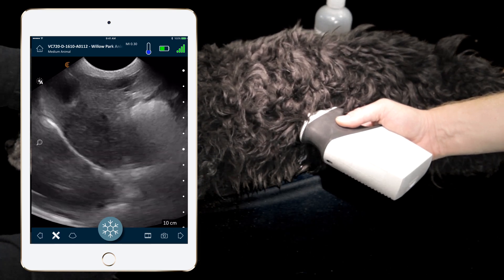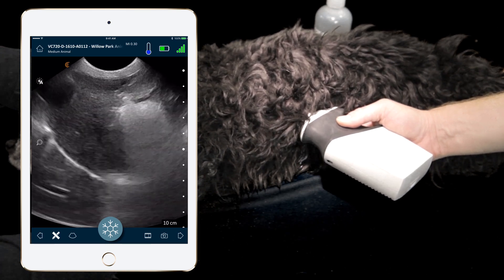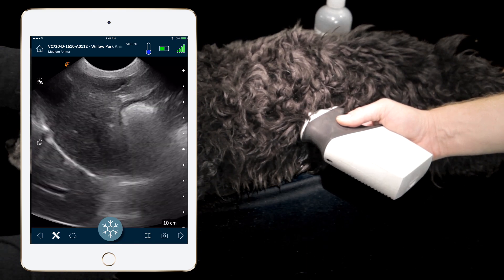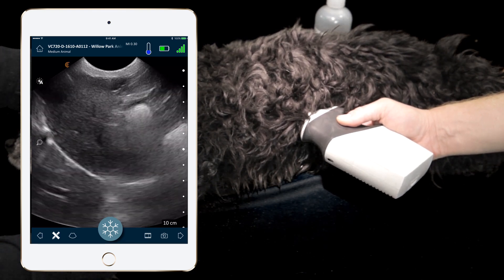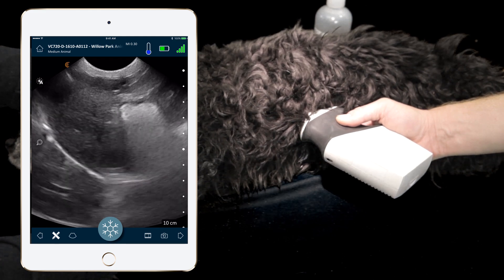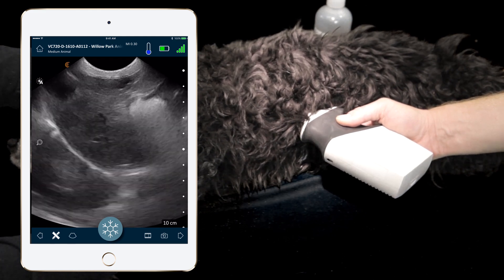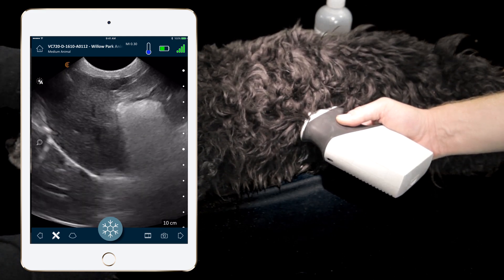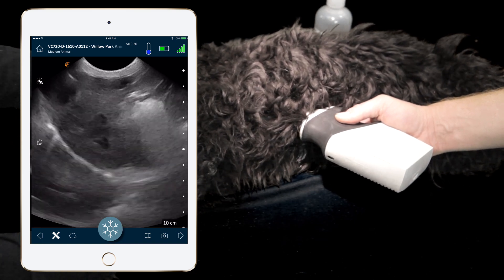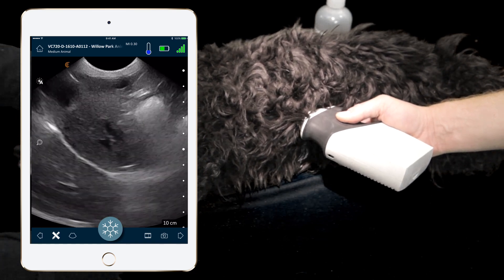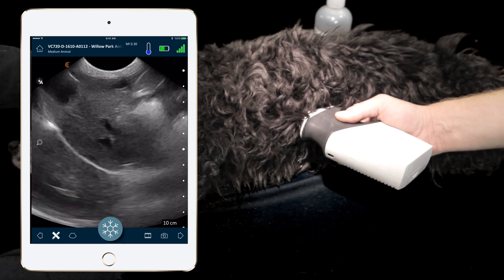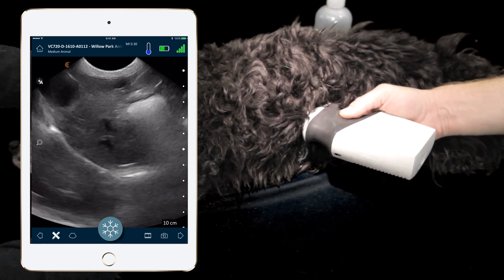We're looking at the pericardial and pleural space. In this image we can see mirror artifact — the reflection of the liver in the far field on the distal side of the diaphragm. This is important to recognize because mirror image artifact can only occur when there's air on the other side of the diaphragm, which essentially rules out pleural effusion at this location.